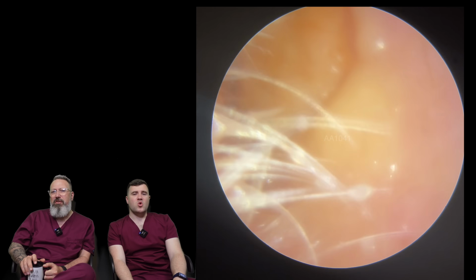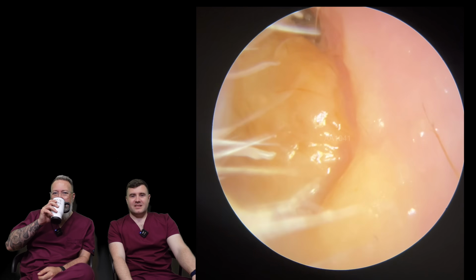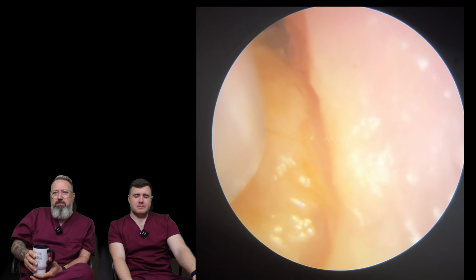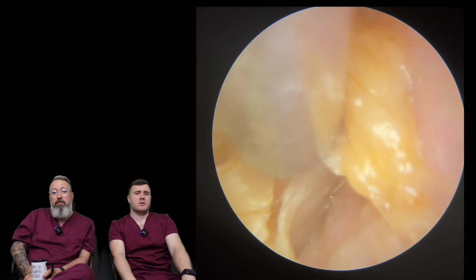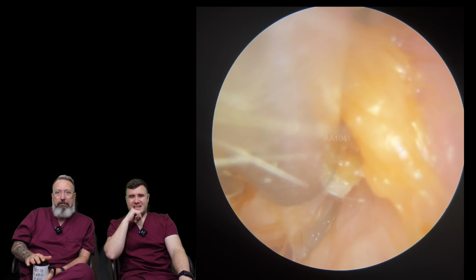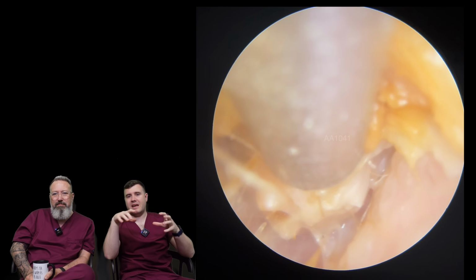Oh, that is really soft. That's an aggressive wax softener being used there, or a lot of oil, one of the two. So I think this is more sodium bicarbonate. I think it was sodium bicarbonate the patient's been using. Bleaches it, doesn't it? And it almost goes that whitish sort of colour. It's like very, very light yellow.